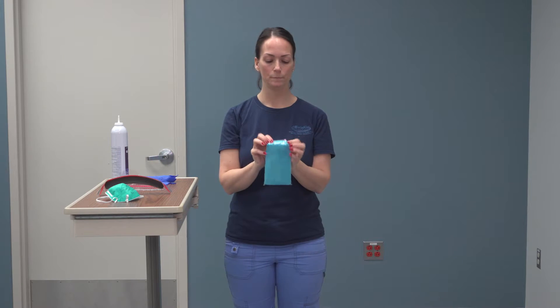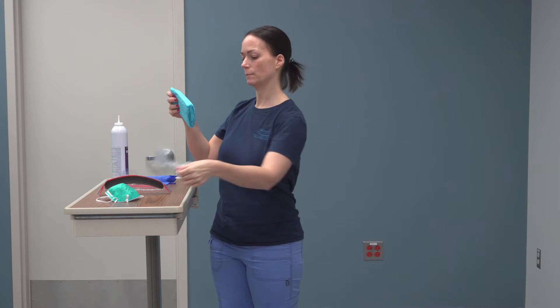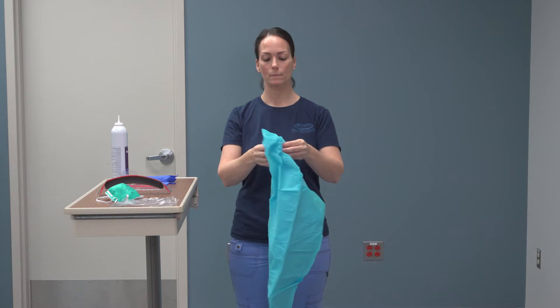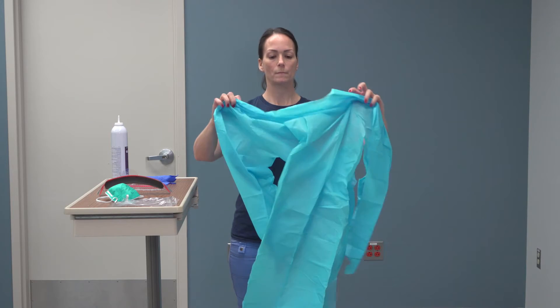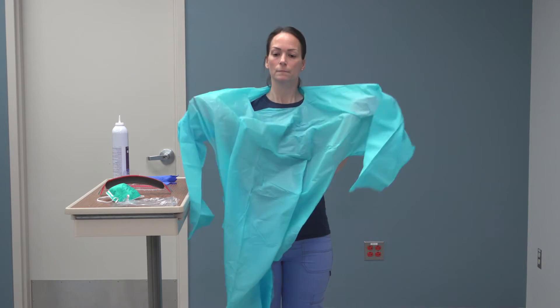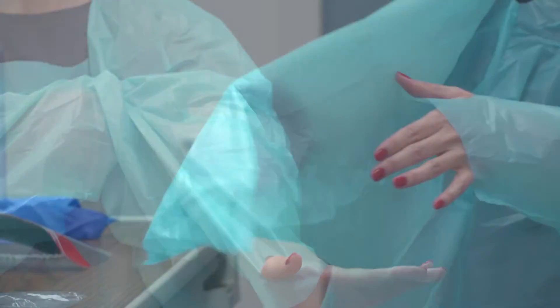Apply blue isolation gown, tying gown in the back only and inserting thumbs into the holes provided on sleeve of gown.